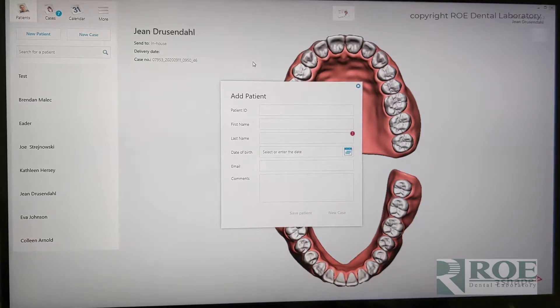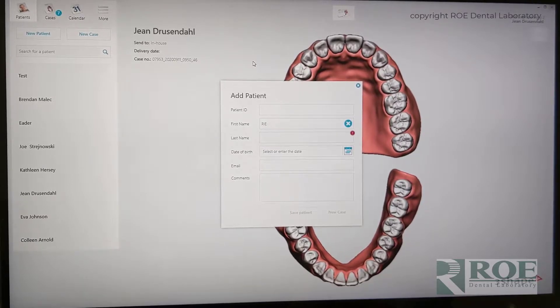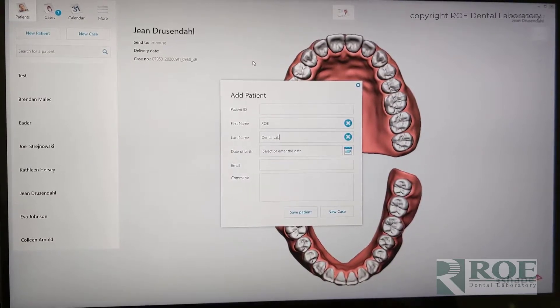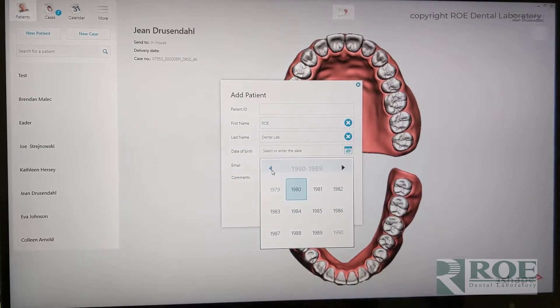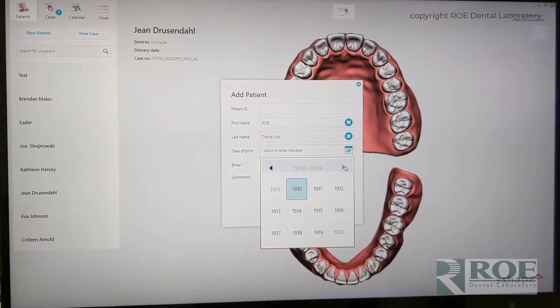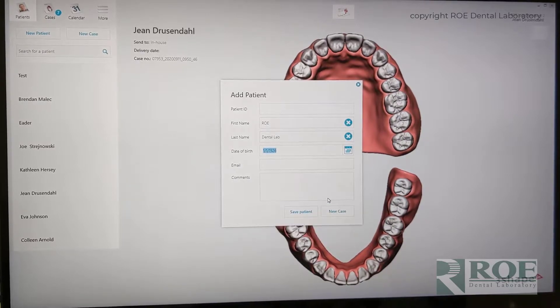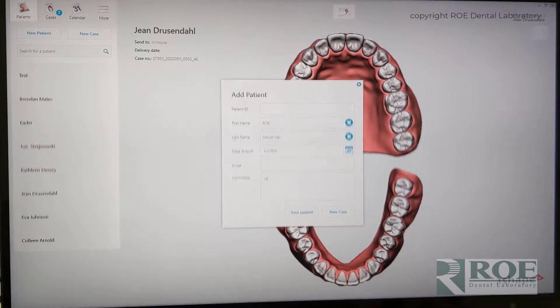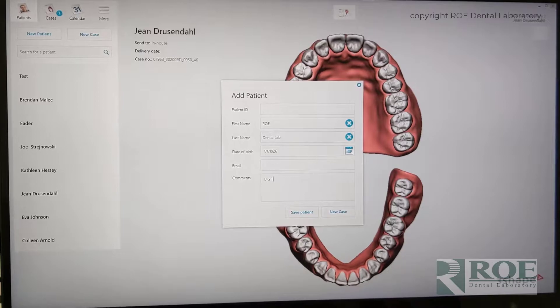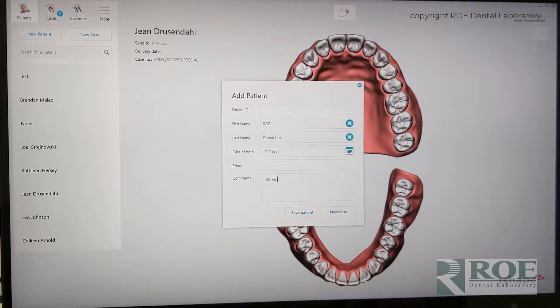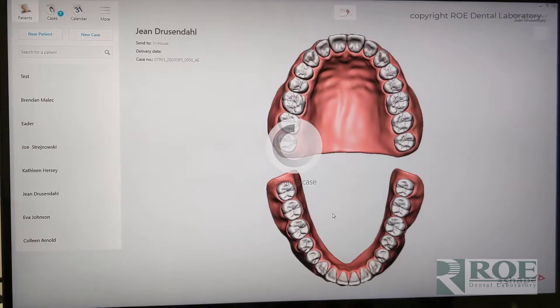The first step is to create an event for the patient. In this case, our patient is Rho Dental Lab, birth date January 1st, 1926. We'll call this the iJIG test and new case.